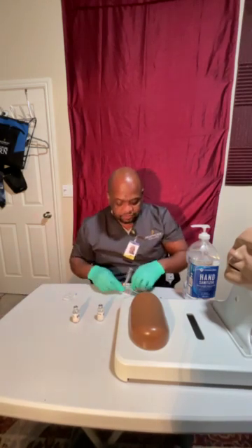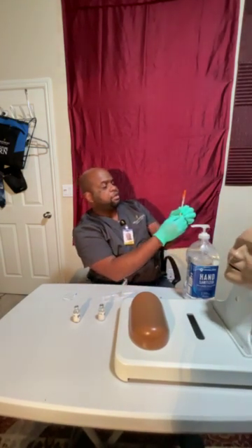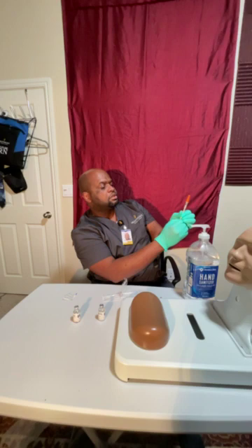Okay, now for prepping, I have the syringe here. With the cap still on, I am going to draw up 8 units of air. Here we go. 8 units of air. 1, 2, 3.